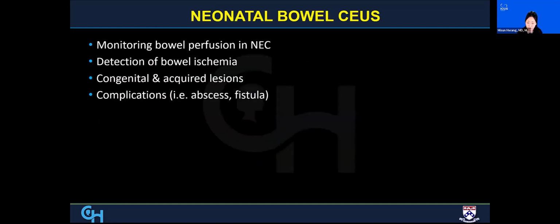So now I wanted to move on to neonatal bowel contrast ultrasound applications. Admittedly, this is a topic that needs to be further explored. However, what I've found very, very useful in the clinical setting is actually monitoring bowel perfusion and assessing bowel ischemia. And there are several cases, and one of which I'll show was very, very helpful for clinical management. These are some of the potential indications that this technology can be developed for, and I'll show you some examples.